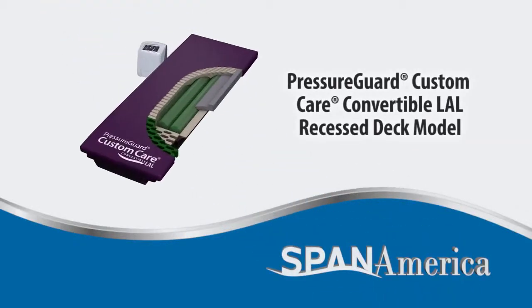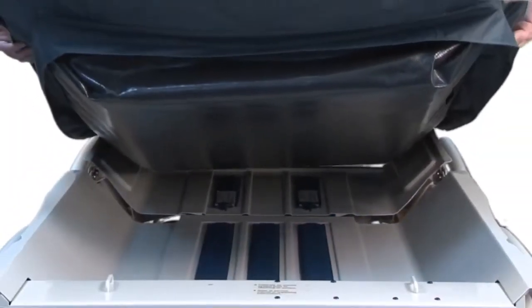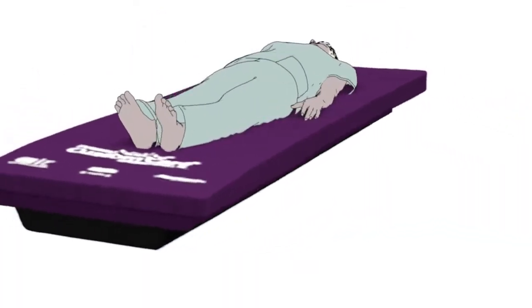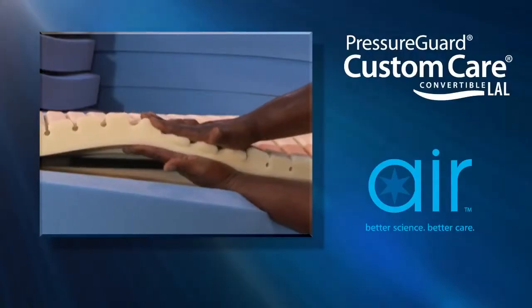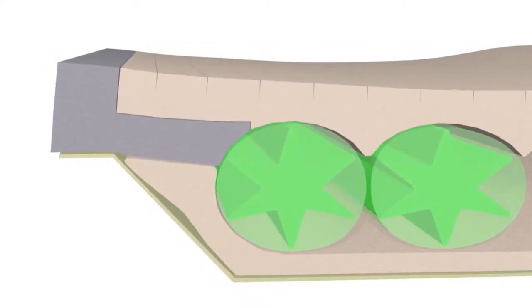Our Pressure Guard Custom Care Convertible LAL Recess Deck Model is one of a series of SPAN surfaces that accommodates the unique challenges of the recess deck bed design. These surfaces bring a combination of proven therapeutic and safety features to recess deck beds.